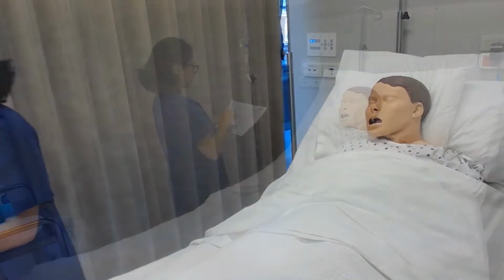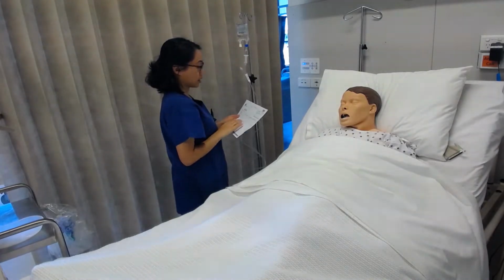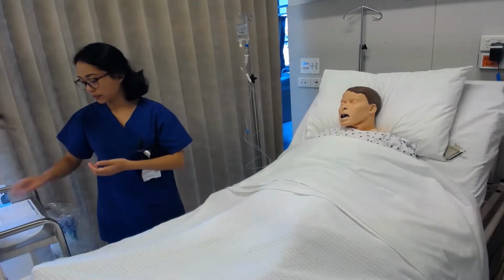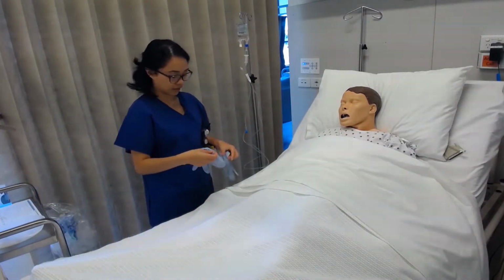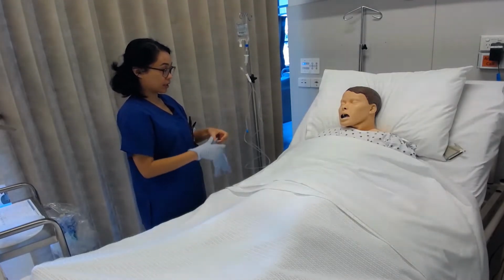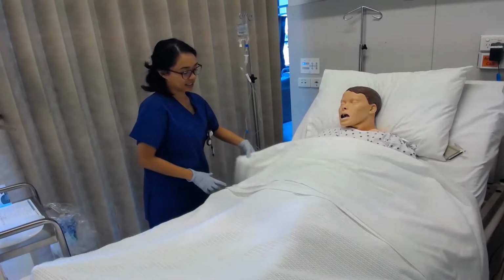Also, ask about allergies. The third check must also involve the comparison of the product label on the vial to the prescription and the third check of the IV fluids. Do all 5 rights for both the IV fluid and the medication.